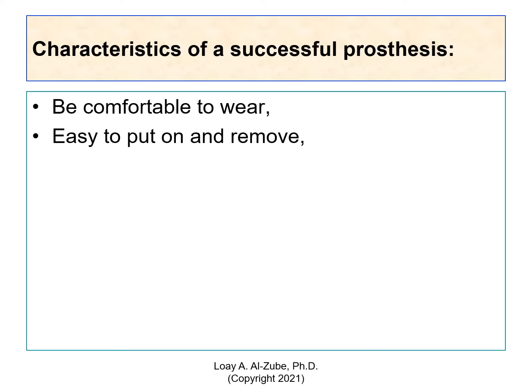Now, there is a debate between do we need to have a larger number of parts or a smaller number of parts in our prosthetic. Because we have 3D printing capabilities, we're using more and more plastics in these prostheses, and they're made of smaller parts. If you are caring about functionality, you need more parts. If it's just aesthetic, fewer parts. But the subject needs to be trained, and the prosthetic needs to be easy to be used by the subject. And we are the ones who are going to train them alongside the physical therapist.